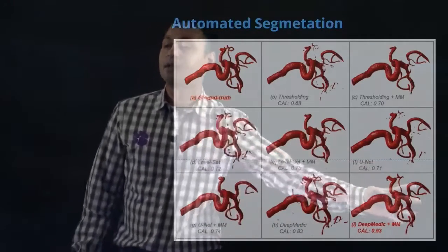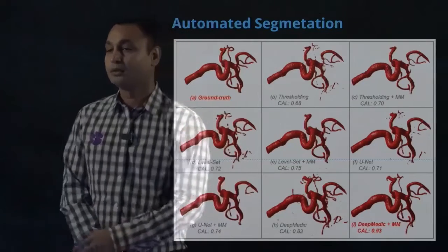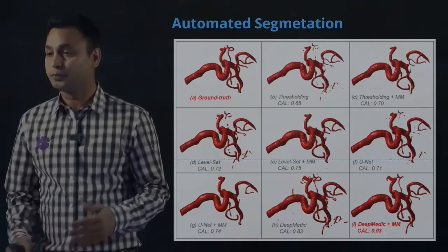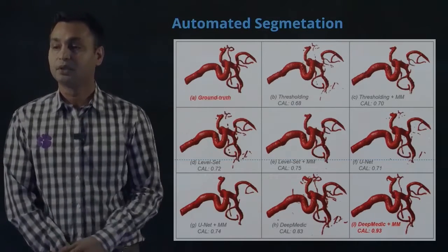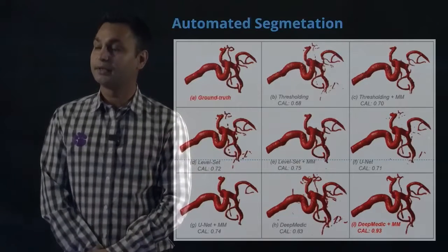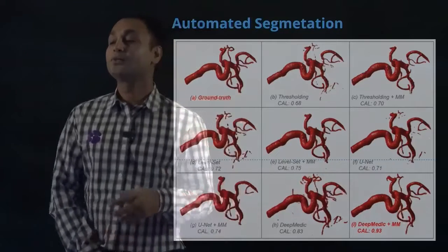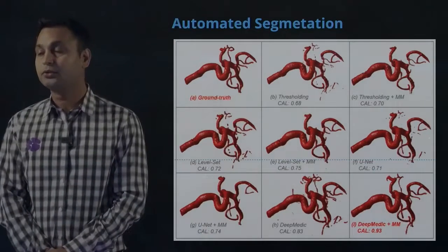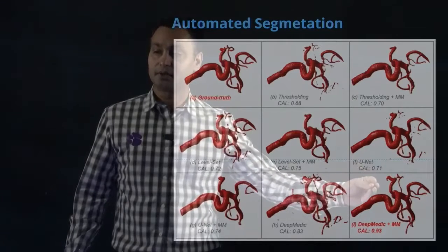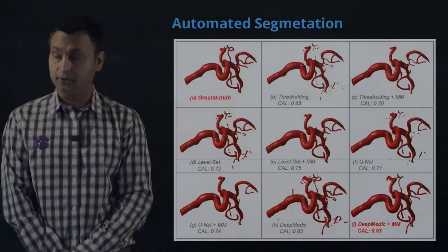Once we have this, we can provide it to a doctor, who can use this image to prescribe the next treatment steps. A couple of things I want to mention: pre-processing of data is there, but we also did post-processing. One artifact of the CNN is that on top of the clean images, there will be some disconnected parts and other things in the output.